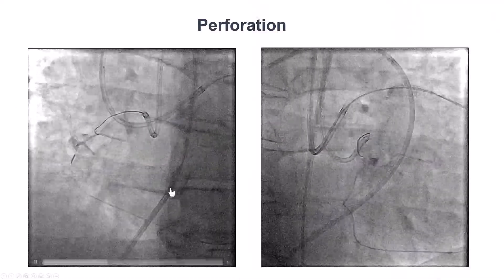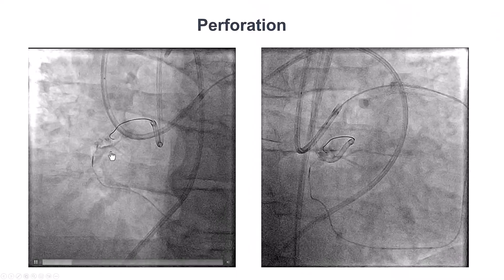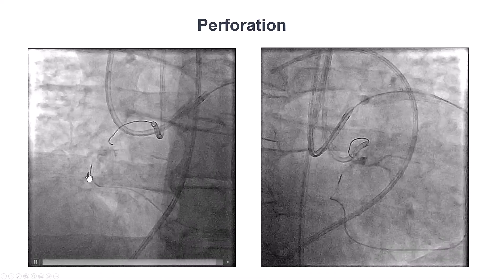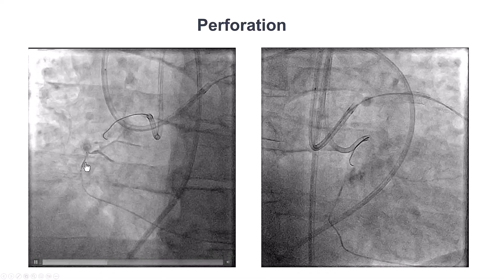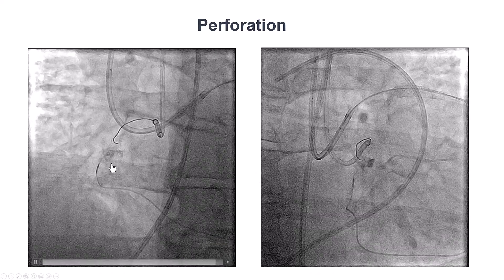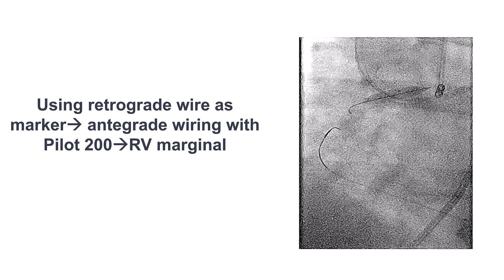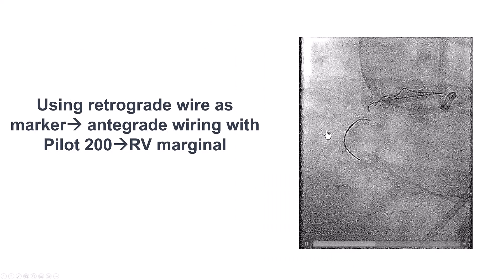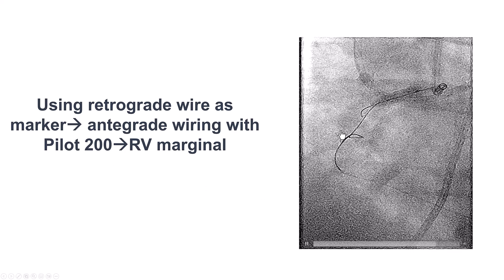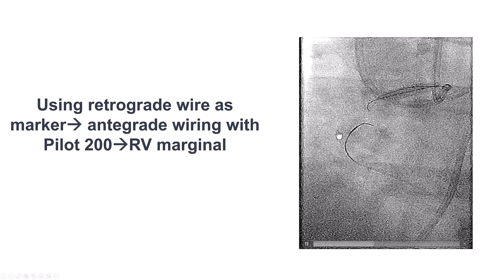We did another distal tip injection and unfortunately there is some staining at the distal cap — we have a small wire perforation distally. Fortunately, we had not advanced the microcatheter further down, and we can see the contrast is remaining in that segment of the vessel. We ended up leaving the retrograde wire as a marker, not wanting to perform too many crossing attempts given the distal wire perforation.